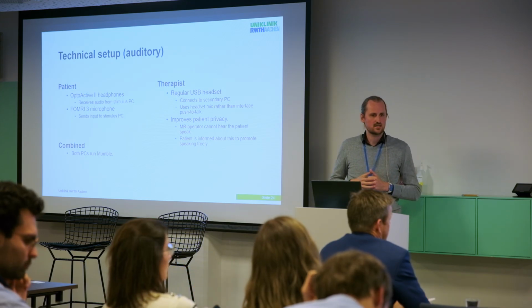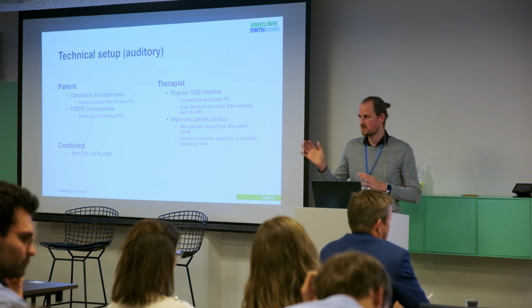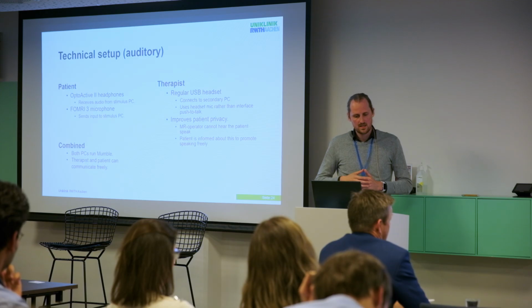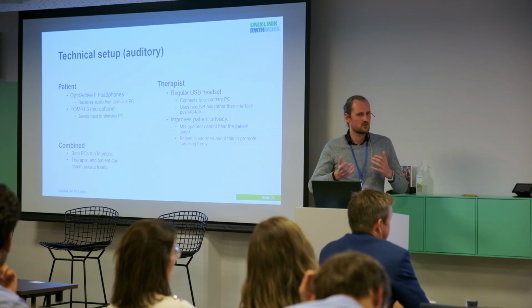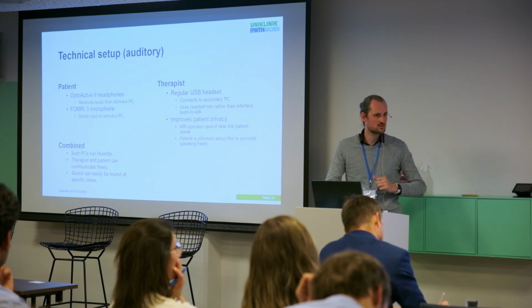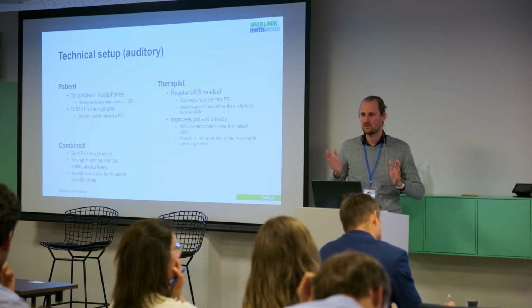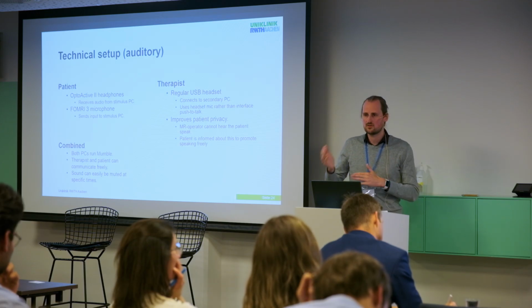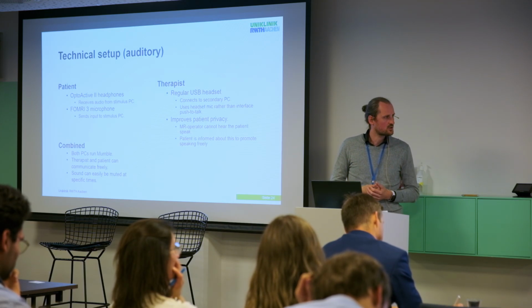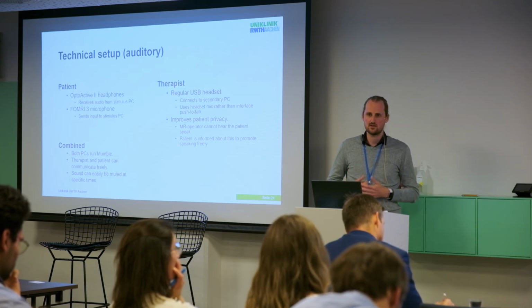So, how can the participant and the therapist communicate with each other? Exactly the same as in our hyperscanning study, we run Mumble using this locally hosted server, again, especially with patient communication, happy ethics department. And now the therapist and the patient can communicate freely. And again, because of our hotkeys, we can mute the participant and the therapist in between whenever we want to start a new measurement or have a short break. We can always mute them, which makes the entire process relatively straightforward to run once you get a bit familiar with the operating procedure.